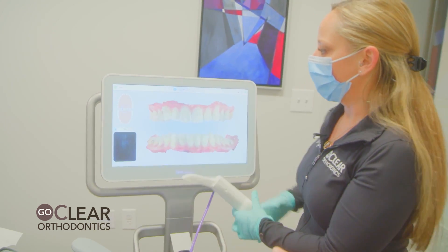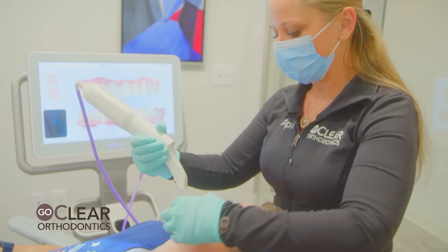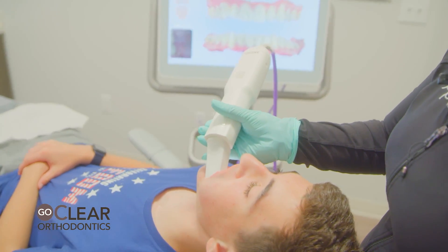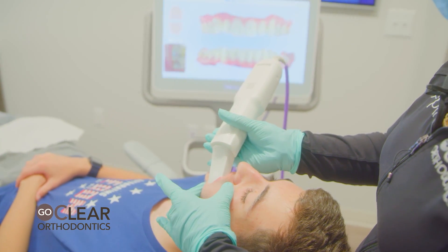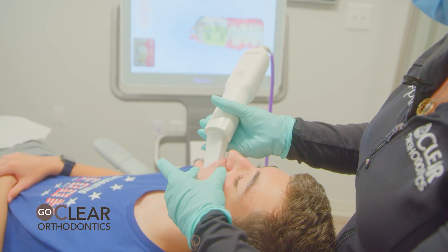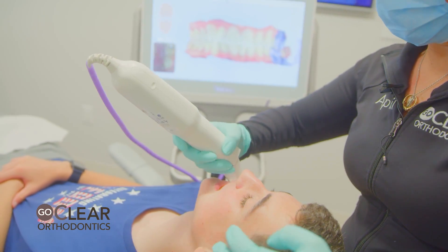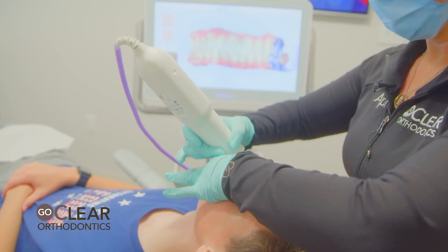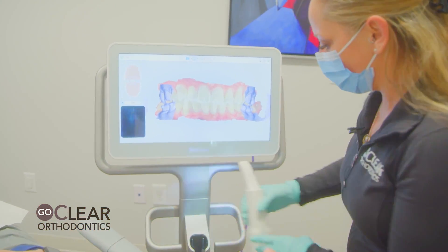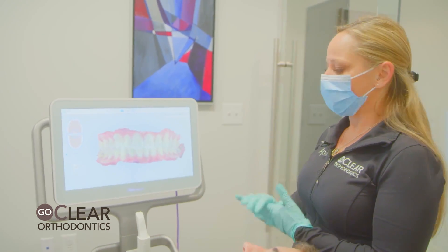Upper looks good. Now we're going to get the bite — always do the left side first. Go in with the wand tip facing down, cheek out, wand tip in. Twist as you push the cheek out. Bite down, hold the cheek slowly, zigzag up and down. Once all the teeth pop up, you've got it. Same thing on the right side — wand tip facing down, twist as you push the cheek out, hold the cheek slowly. All the teeth popped up. Done. Because we made sure all the blue spots were filled in as we went, there will be no blue spots at the end to go back and fill in.